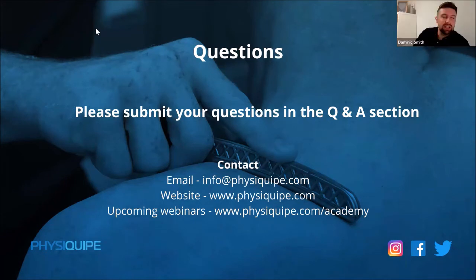So Michelle Dowd, thanks for your question. She's asked, how long would you use the IASTM tool for roughly to achieve the effect that you want? Yeah. So I generally found that over each area, you can do it for 30 seconds to a minute, and you're going to get the effect that you're looking for.